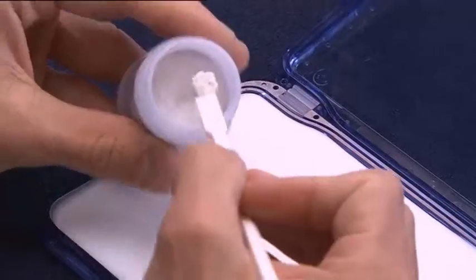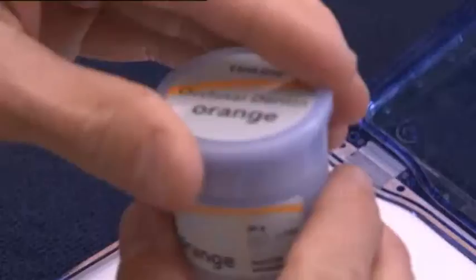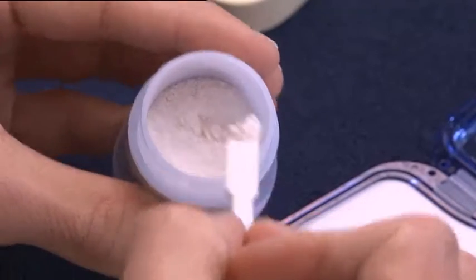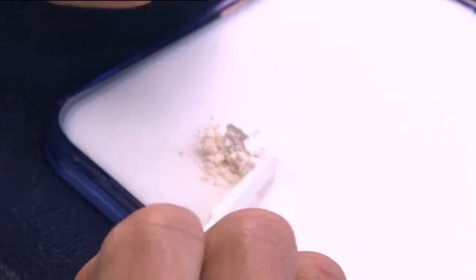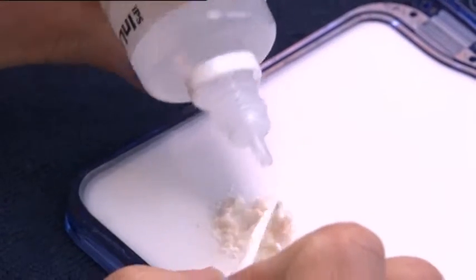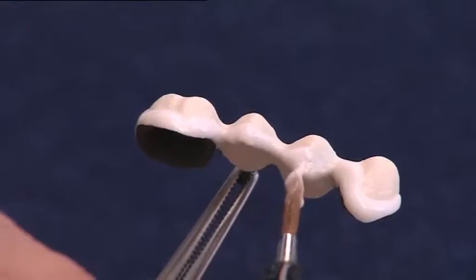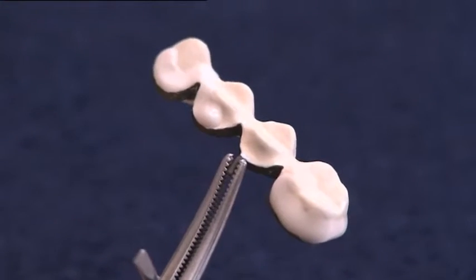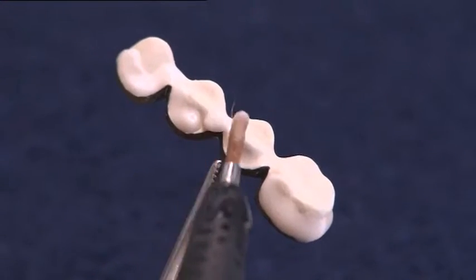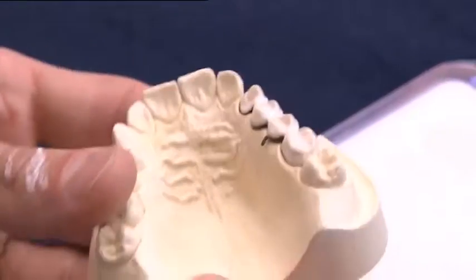For shade adjustments in the cervical region, deep dentin materials can be used. The shade can be intensified with, for example, the occlusal dentin materials. The deep dentin materials are mixed with the buildup liquid. The cervical, interdental, and palatal areas are layered with deep dentin materials. The framework is carefully placed on the model, and the cervical and occlusal areas are supplemented.